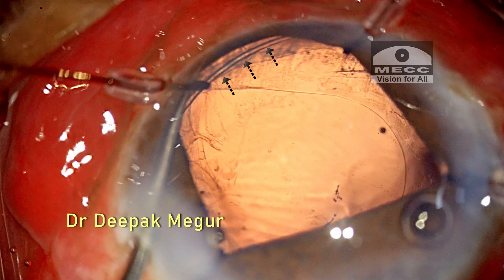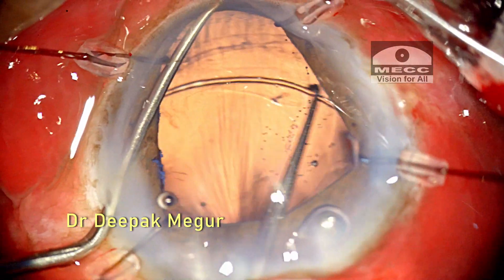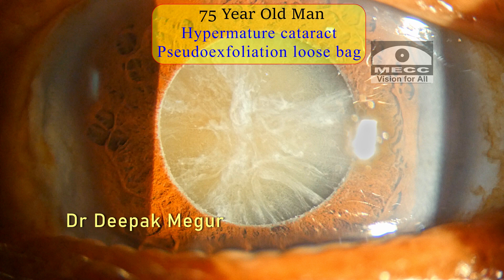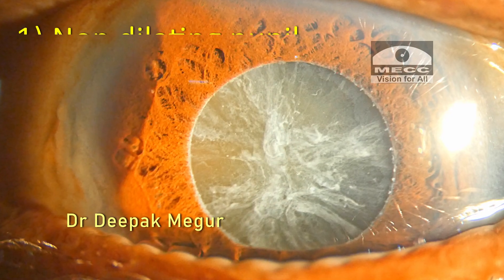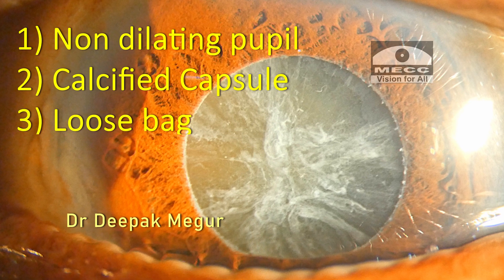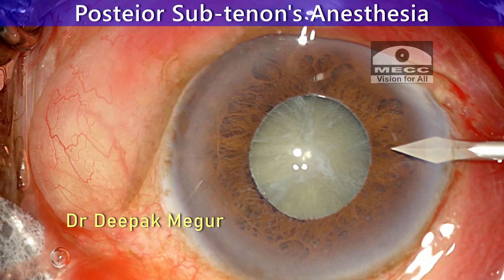Today's case had an interesting but rare intraoperative difficulty to deal with, so let me share my experience. This is a hypermature cataract in an elderly man with pseudoexfoliation, so we have all the associated issues expected in such eyes: a non-dilating pupil, a calcific capsule, and a loose bag with generalized zonular weakness.